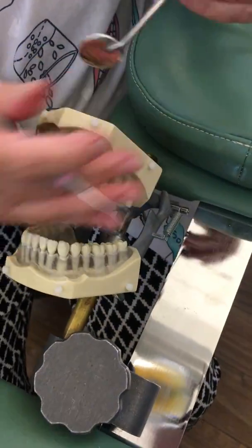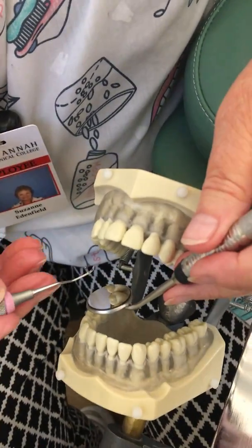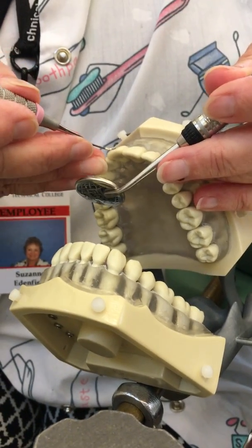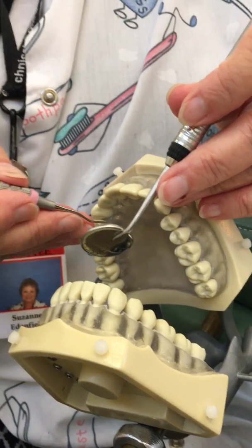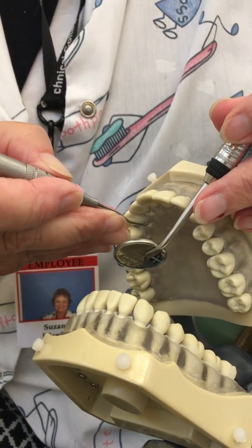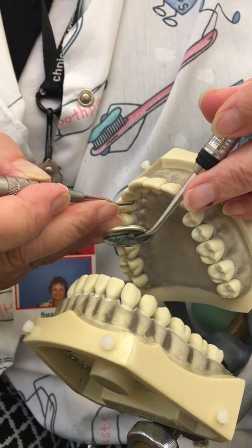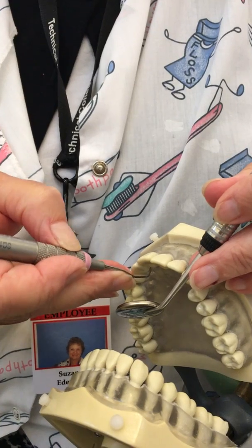Now we're going to move to area two. I'm going to use my mirror for complete indirect vision and go in the away direction. An easy way to figure out the correct working end is: if it's wrong in one, it's right in two, because the low blade is then against the tooth. I'll pull in toward the tooth, then open toward the lingual, maintaining an open stroke with my palm parallel to the arch and shank parallel as I come around the corner — leaning my hand so all three fingers stay together.